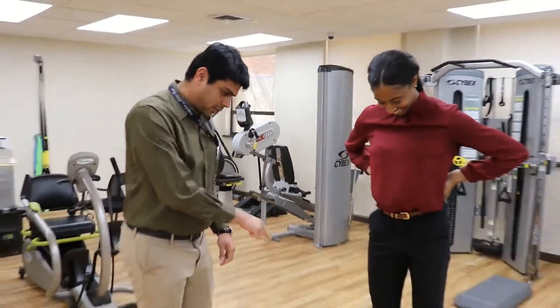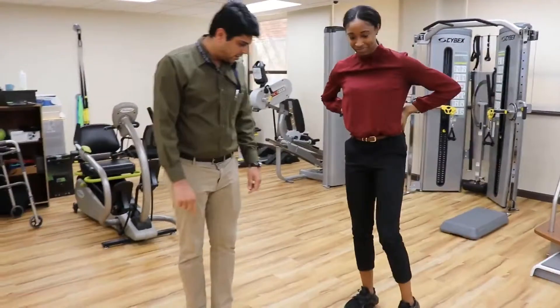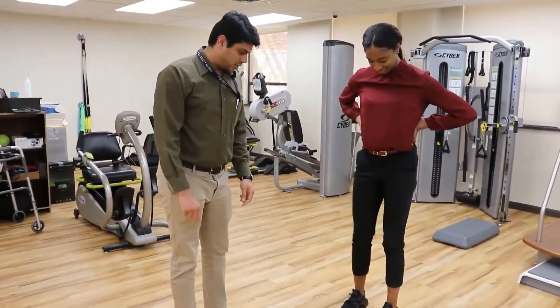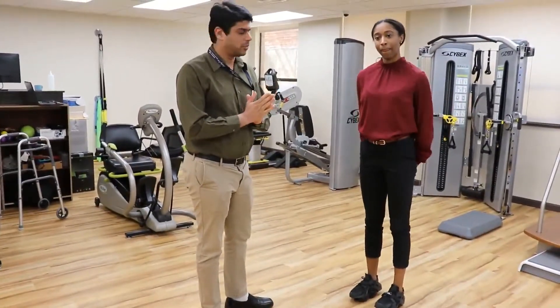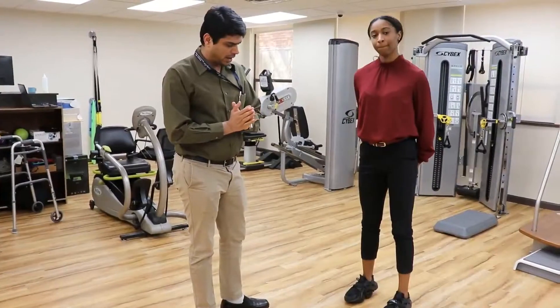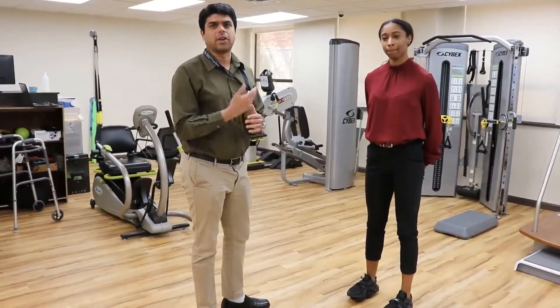We actually have these very interesting-looking devices on her feet — under her feet, actually. This is called a Step Right Stability Trainer. This is basically going to be used for people with foot and ankle injuries and if you're looking to go back to active sports or to leading a more active life.